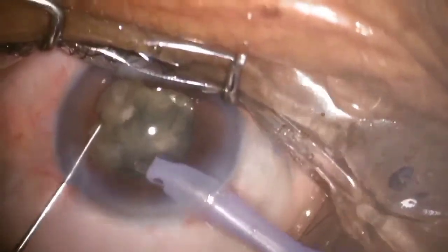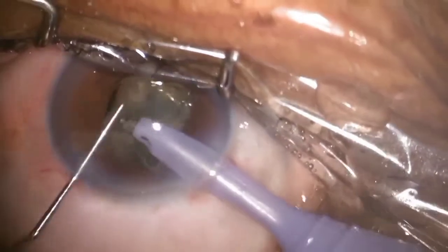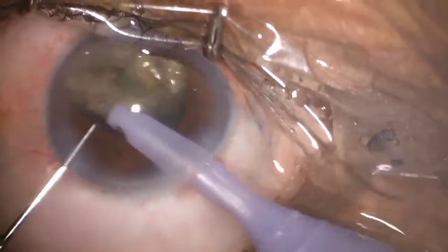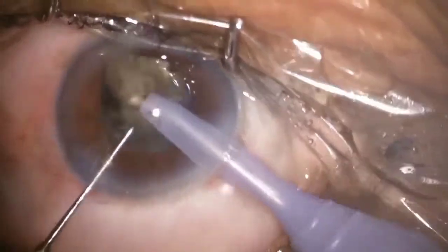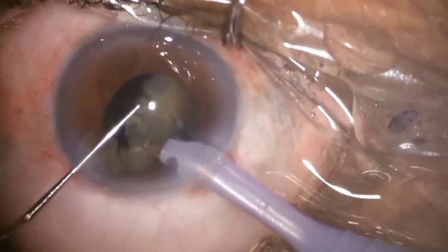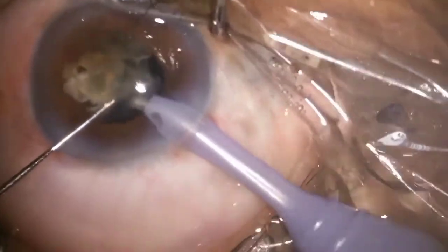I came to notice that the peripheral part of the nucleus got emulsified, but the central part, which is hard to break, was taking time because of the fibers present in the dense cataract.